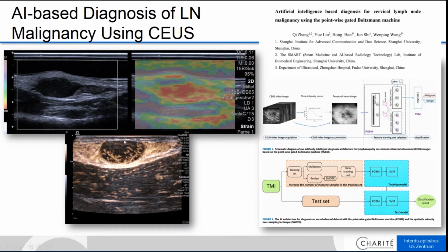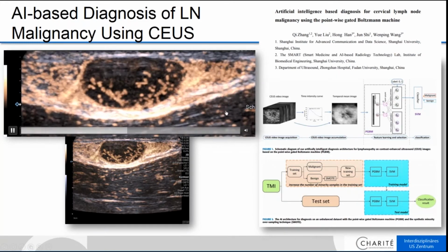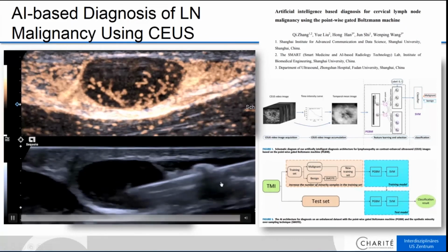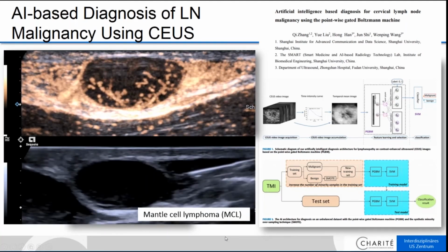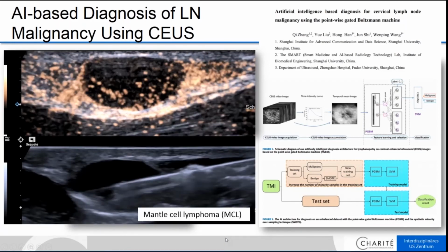And this is once again a soccer player. There was an injury on the elbow, but it looks very strange. This is definitely no hematoma. It's very stiff, and we see vascular architecture inside. And the next step is to use this contrast application: a regular lymph node, a suspicious one, and then we picked up this material using a puncture procedure with a 14 gauge needle, and the final result was a mantle cell lymphoma for this sportsman, a very rare case in this localization on the skinny surface of the elbow.